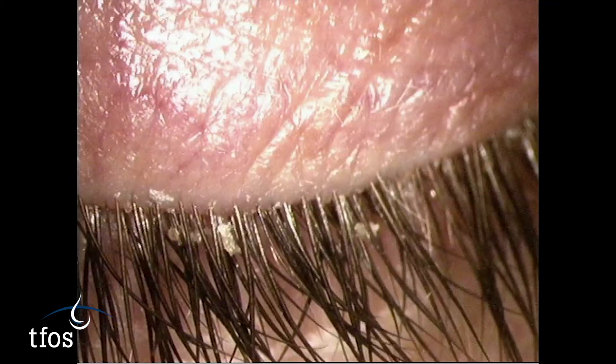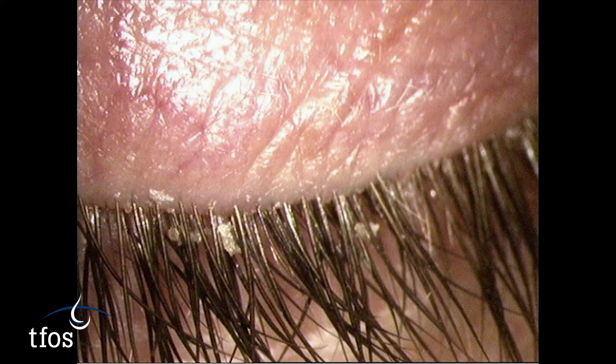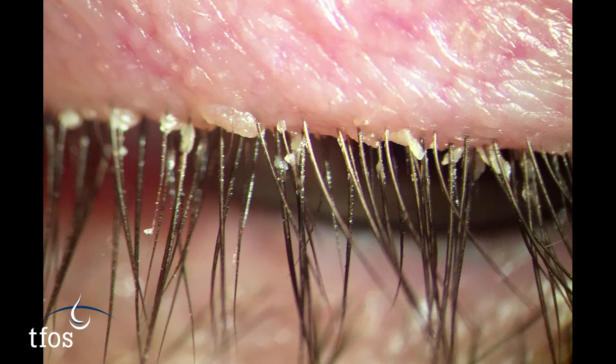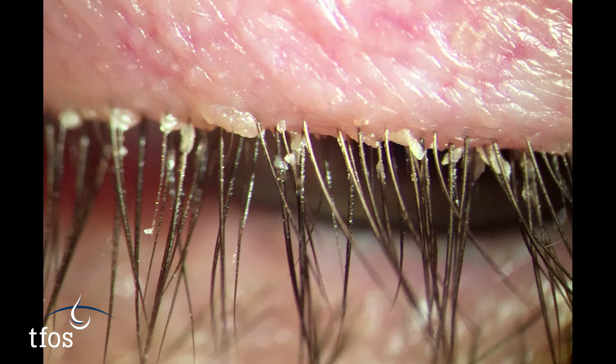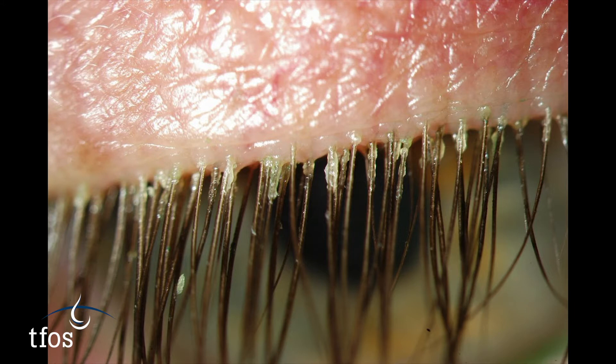Greasy scales tend to be more commonly associated with seborrheic blepharitis, while flaky crusting might suggest the presence of staphylococcal blepharitis. The presence of cylindrical collarettes has been described as pathognomonic for demodex infestation.